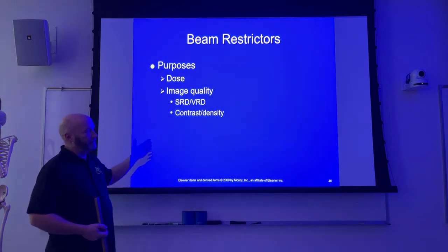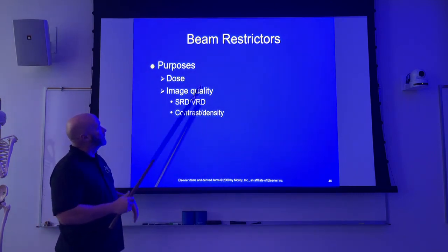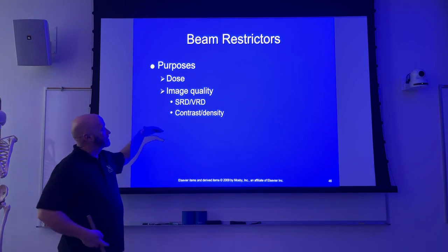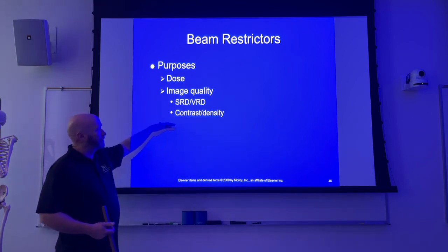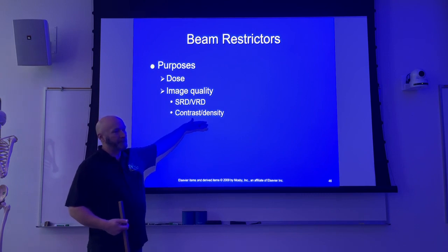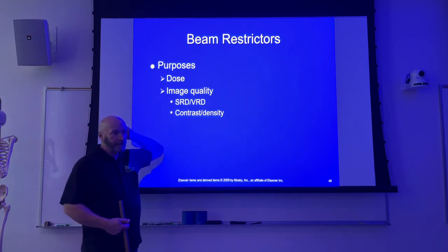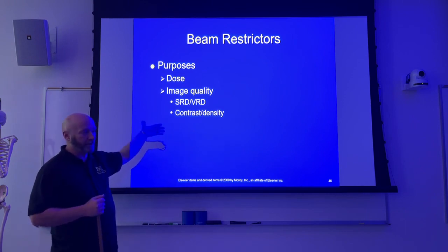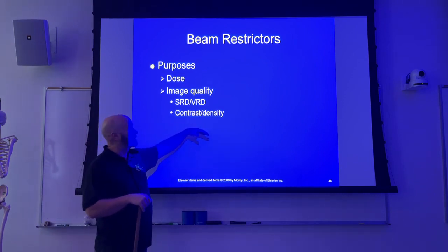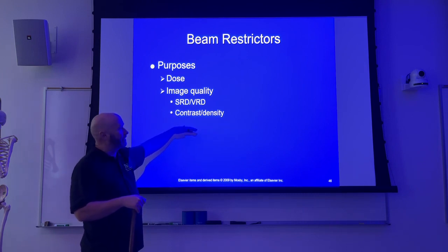Don't really see that all that much anymore. We still do have dose implications. There might be some, I don't know, negligible contrast differences between collimated and uncollimated. Compared to what we saw with screens and films, it's just not as prevalent, it's not as obvious as what it used to be. It still affects it.